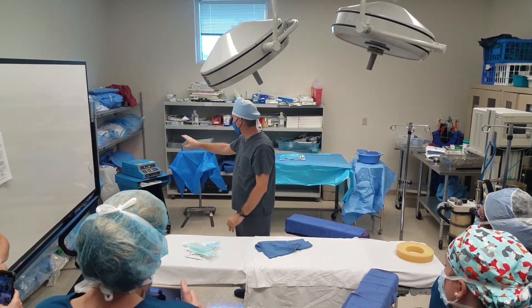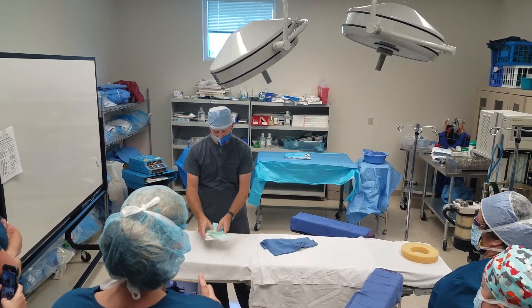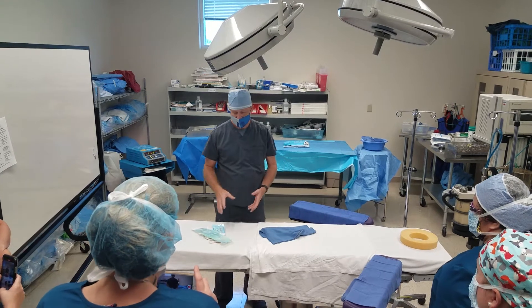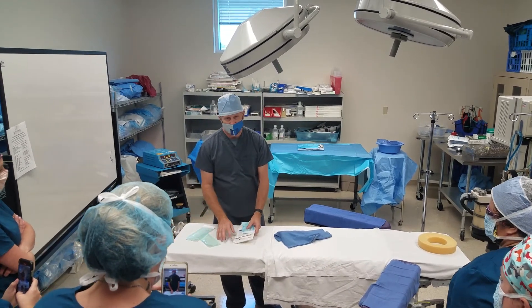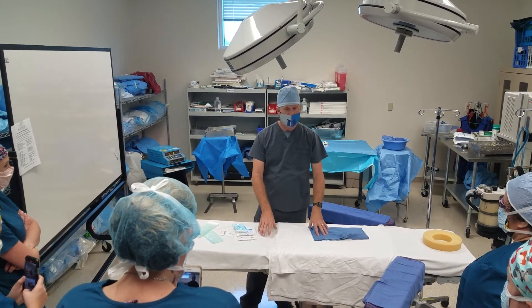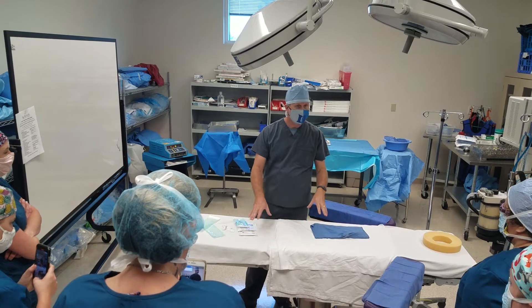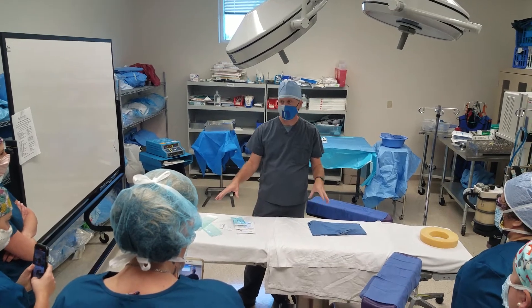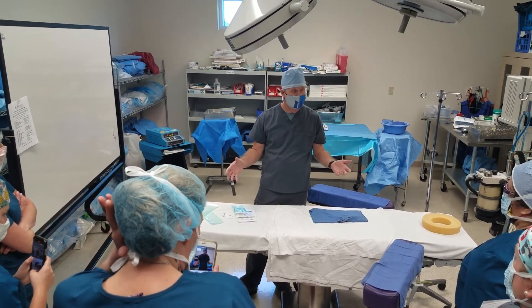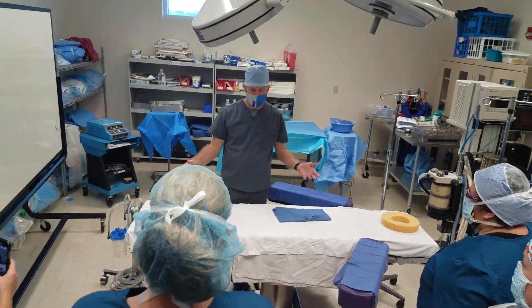Alright, so we've created our sterile field. We have quite a bit of area here. We've picked things — gowns, gloves, that sort of thing. This is a really small set of instruments. Usually we'll do this on the table or the back table. There might be 50 or 100 things here — 100 is probably high, but it could be a lot. If it's a big case like an open heart, there's lots of stuff.